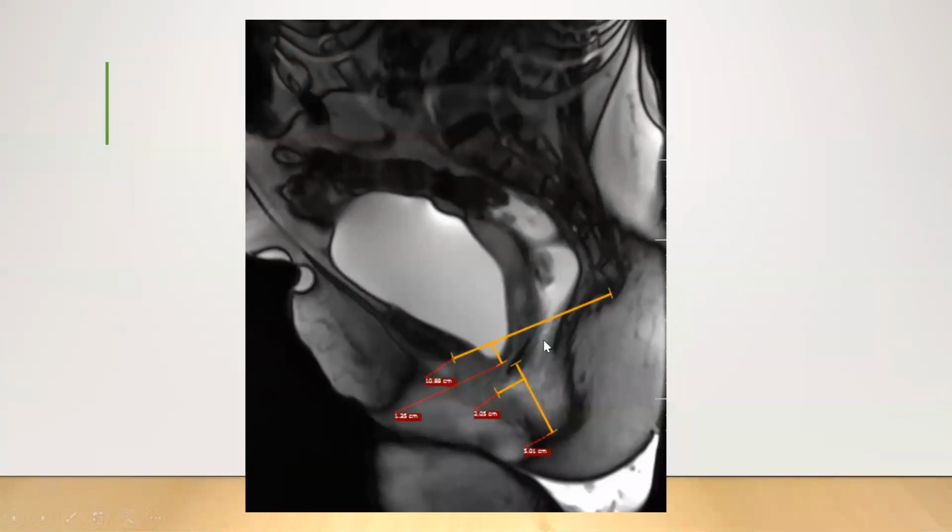The same patient again, coincidentally, also showed, during the defecation mechanism, the urinary bladder descending below the pubococcygeal line, just about 1 centimeter, so not really a significant finding. But again, you can identify an anterior rectocele in the same patient. But primarily in this particular patient, I was trying to show that the patient had some indentation by the puborectalis sling, but subsequently, as the patient tried to apply more and more pressure, the patient was able to evacuate.